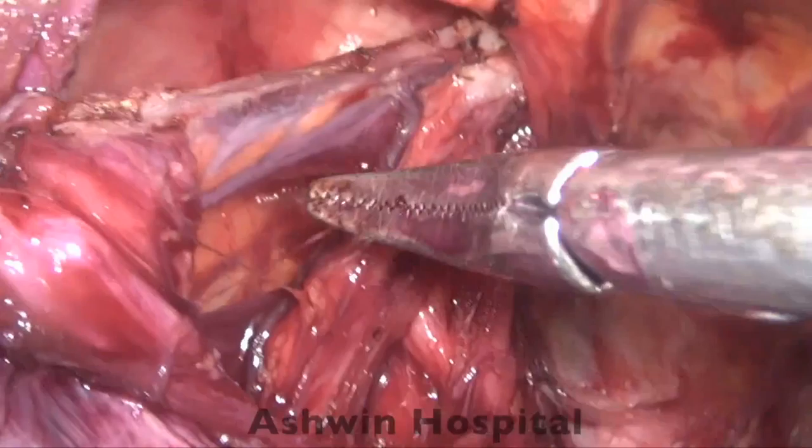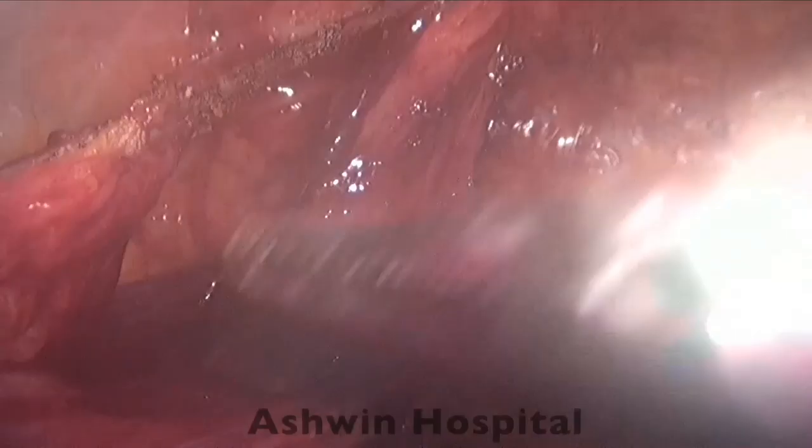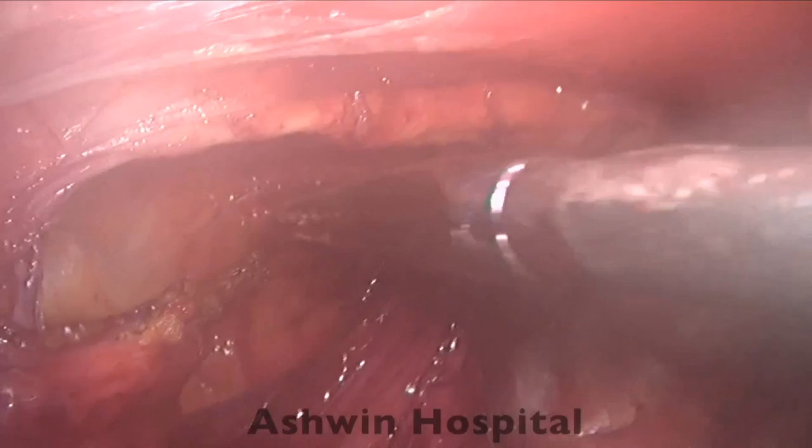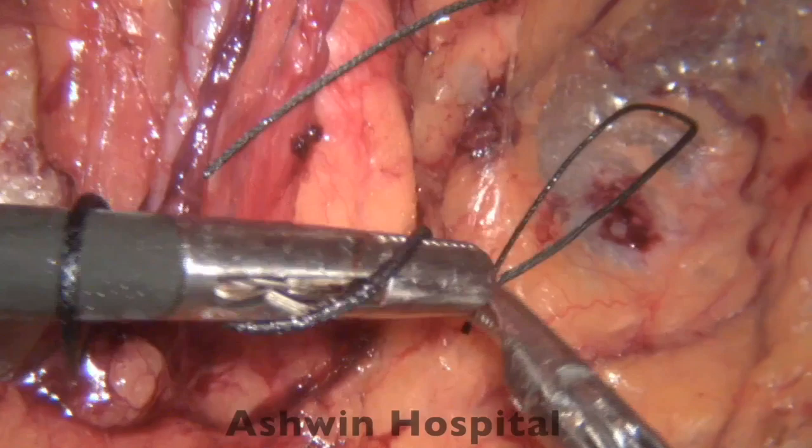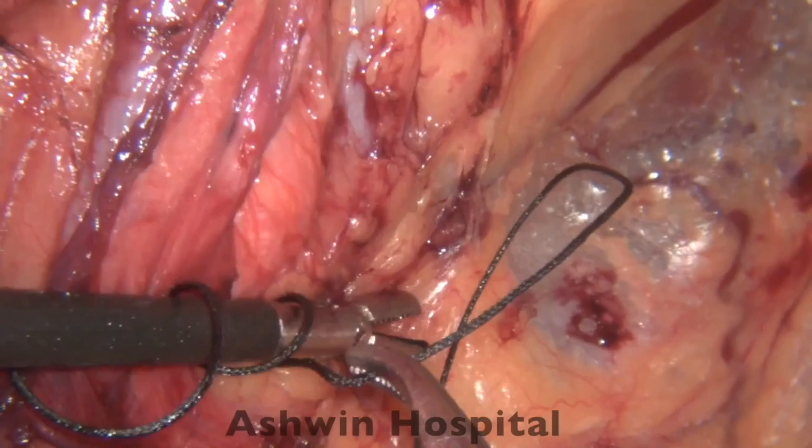We can just enlarge the space. In this case, because it was an incomplete indirect hernia, we were able to reduce the entire sac, and you can see we are able to divide the last final fibrotic attachments, and then the sac is complete. If it's a complete sac, then we can use a ligature like how we are showing it now, and you can do an intracorporeal suturing.